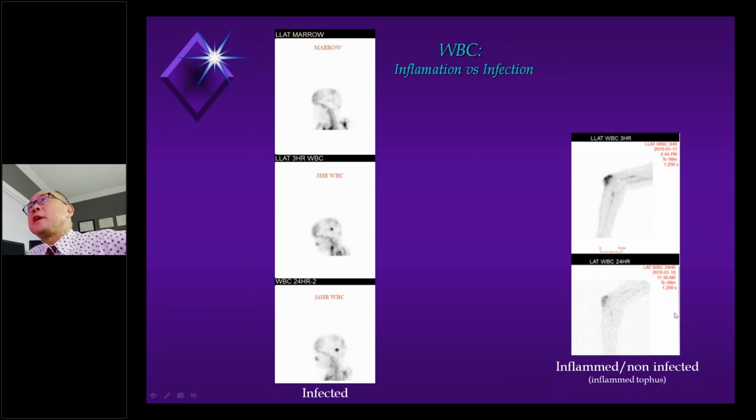And in fact, this case I can tell you is absolute. This just happens to be a patient with gout who is known to have a large tophus in the elbow, and I'm 100% sure this is not even part of the clinical test. It just happened to be in the field of view, and I thought that was a very nice looking picture, and I asked the technician to give me some delayed images.